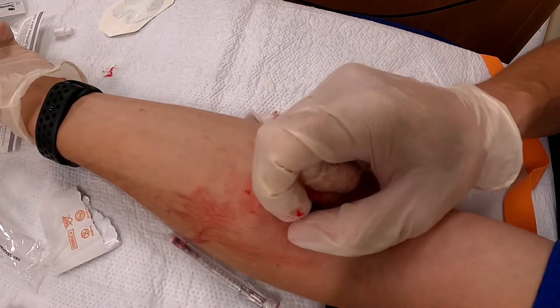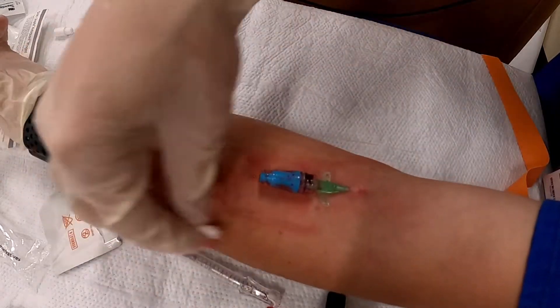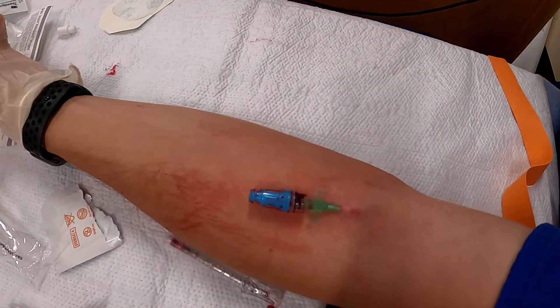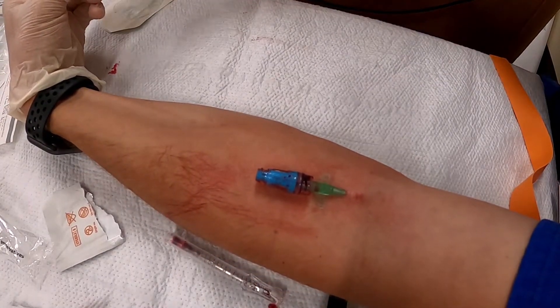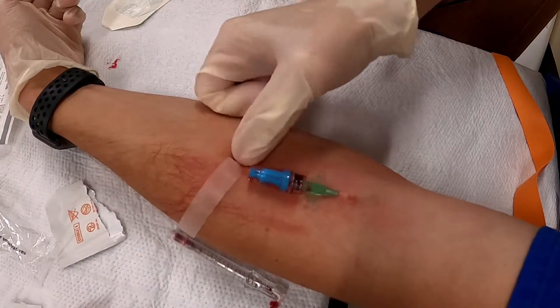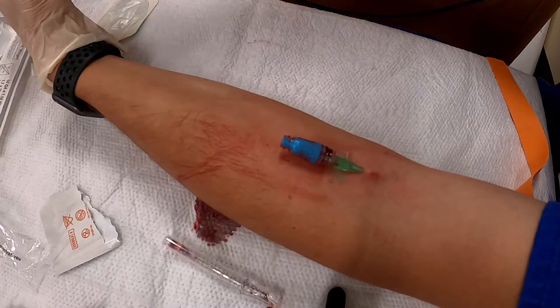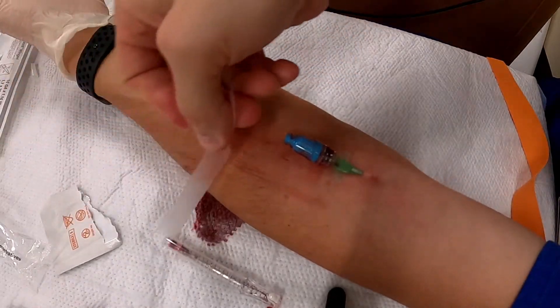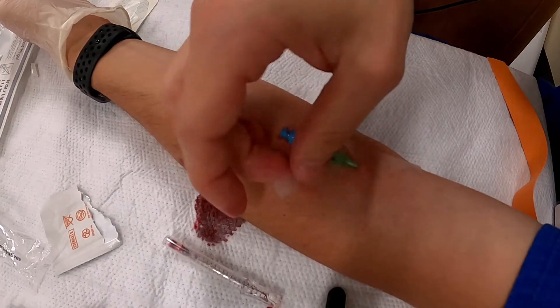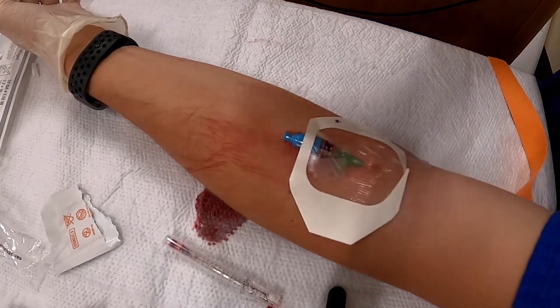You've checked that your IV is patent and applied a clave on it. It's okay to make a mess — we can always clean up messes. I've got a couple pieces of tape prepped, about four inches long and split. If you like your IVs to stay in and not come out, you'll tape them down — not just a simple tegaderm. Then apply the tegaderm, initial it, date it, all that good stuff.